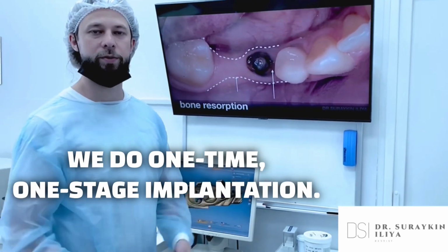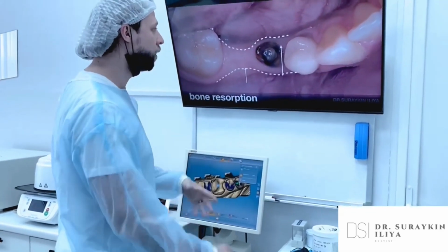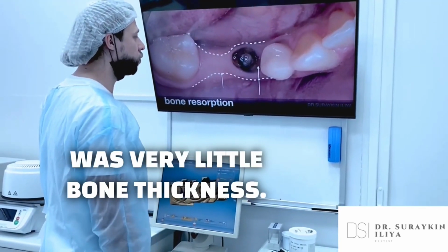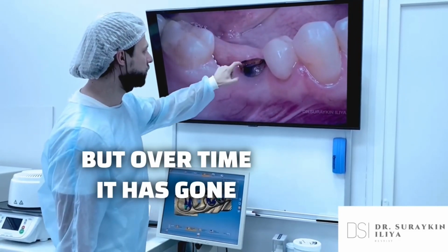We do one-time, one-stage implantation. Here we did. The patient came, today we did the anesthesia, and only then began to remove the root and install the implant in its place. The difficulty was that there was very little bone thickness. Here I showed another option of resorption. When the bone has gone, it should be level, but over time it has gone in height.